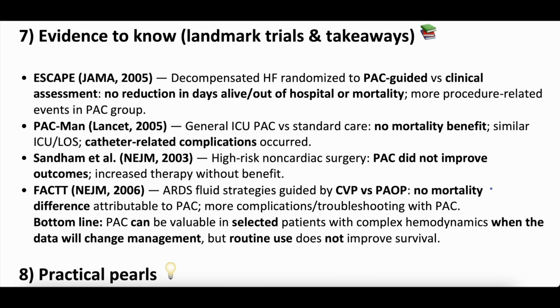So that's not to say that pulmonary artery catheters don't help patients. It is to say, though, that doing it in everybody without really knowing what you're doing, or how you're going to use it, or being selective with the right patients, it probably is not helpful. And it's ridiculous that we have to say that out loud, but that's more what these trials mean, right? So be selective, be thoughtful, know what you're going to do with it and how you're going to use it, and make sure you have an indication that you think it'll be helpful for before you do it.